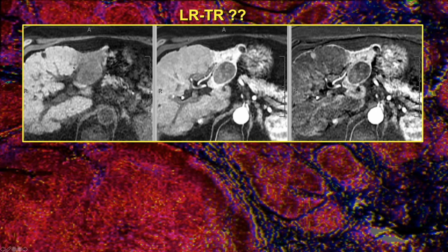Very strongly hypo-intense compared to background liver. Now it's just about iso-intense. So there should be no doubt that this is a mass that has enhanced more than background liver. Now, if this was an untreated observation, you might not want to call it hyperenhancement, but perhaps if you're really confident it's tumor, you could convince yourself that these little nodules within it are indeed hyperenhancing. In fact, notice the morphology of the lesion changes. What's now brighter within the enhancing tumor was darker pre-contrast. And that's another sign of internal enhancement. The morphology changes because there is incomplete necrosis here.